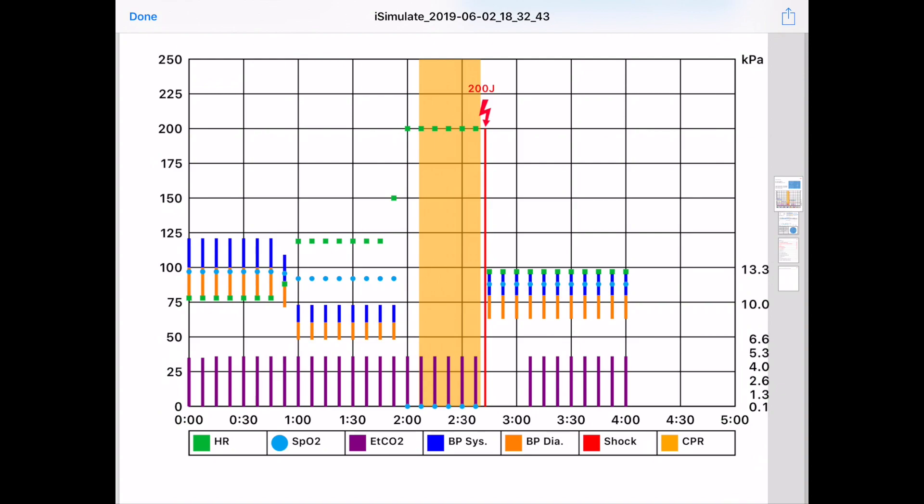Blood pressure is shown also as a vertical bar, but it's split into systolic and diastolic. And where those two meet is the mean blood pressure. A shock is shown as a red vertical line with the energy. And when CPR was done is shown as an orange shaded area.